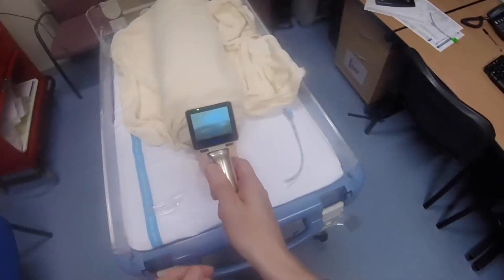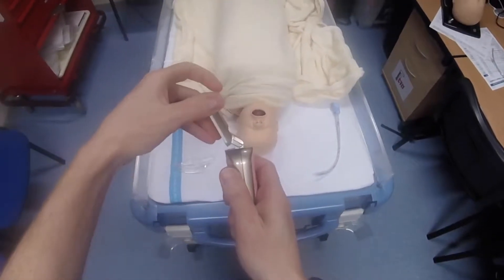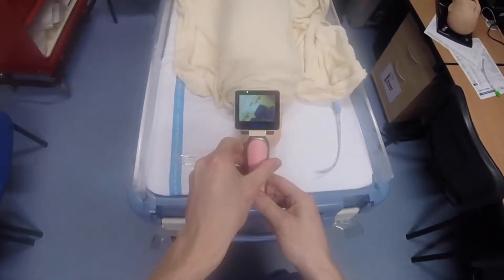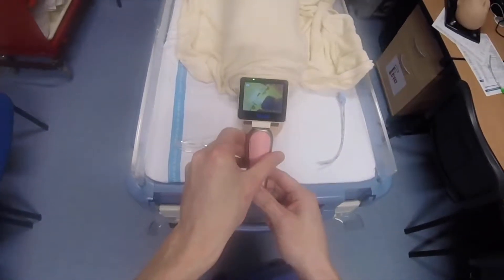One way this would be useful in training: you can have the trainee doing the intubation with direct laryngoscopy and the screen turned to the side so they're blinded to it. The instructor can stand to the side watching the screen and provide tips and advice if the trainee gets into difficulty.